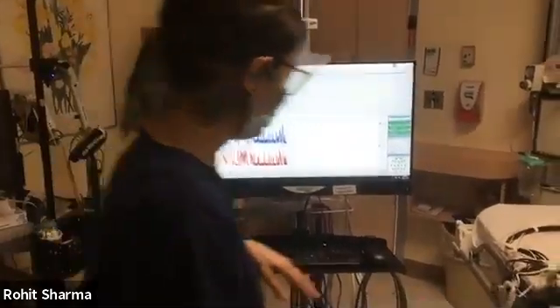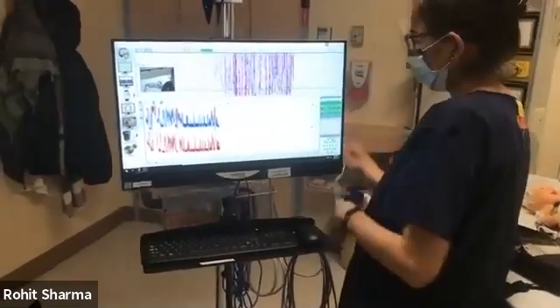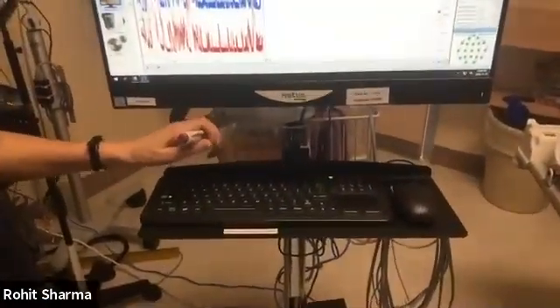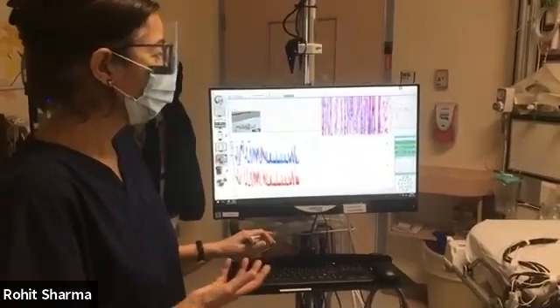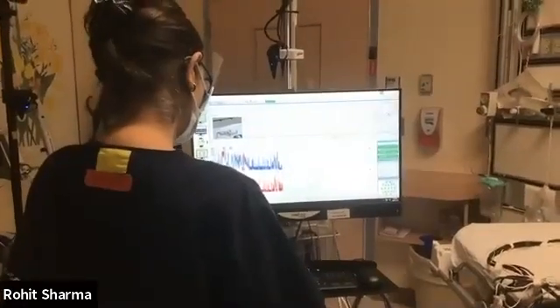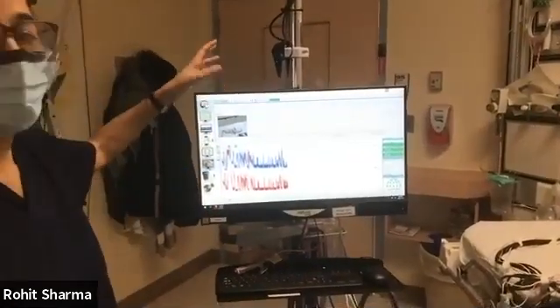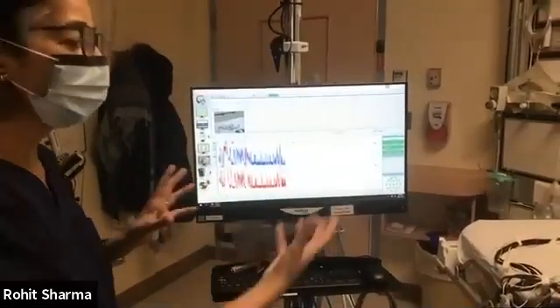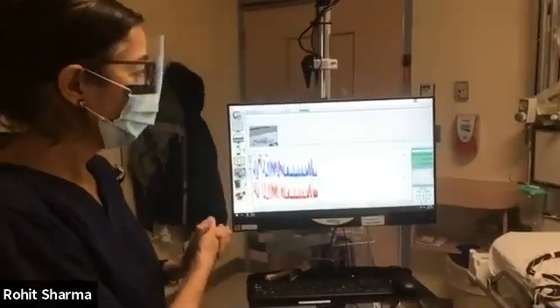The other thing I'd like to point out is that we have an event marker button. This is used in case the patient is having a seizure, or if you want to annotate something, maybe you want to give meds to the patient that we haven't used before, you can press the event marker. You can also type giving patient meds or whatever you were giving on the screen, just start typing. And you can also talk into the microphone. Suppose you're giving a phenobarbital load, or you're giving lorazepam or midazolam, or you increase any kind of doses, feel free to talk into the microphone and you can do the annotations too.